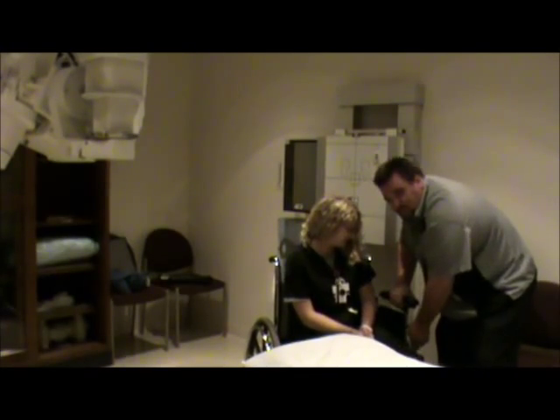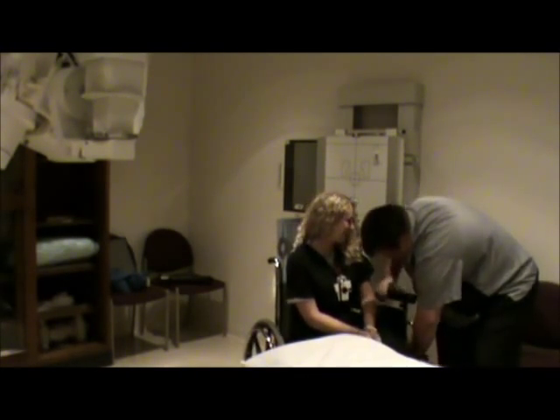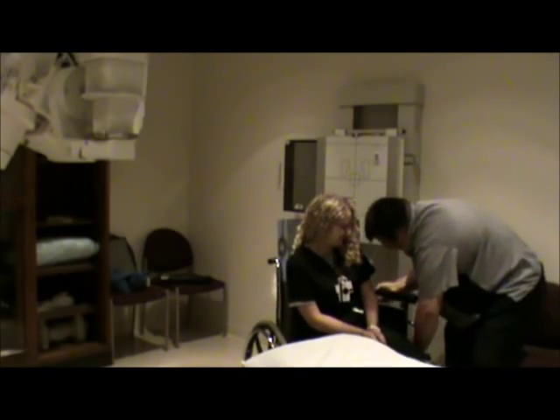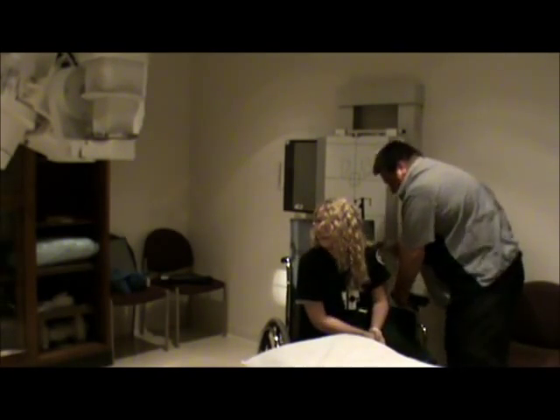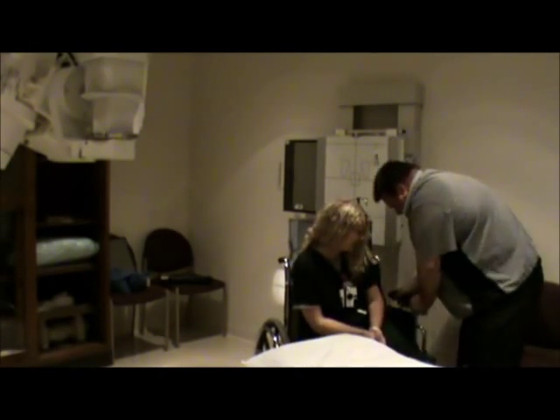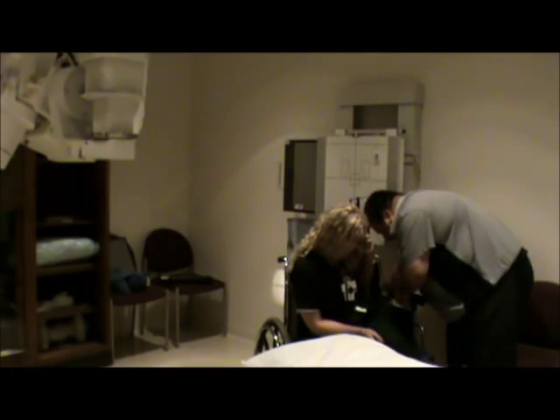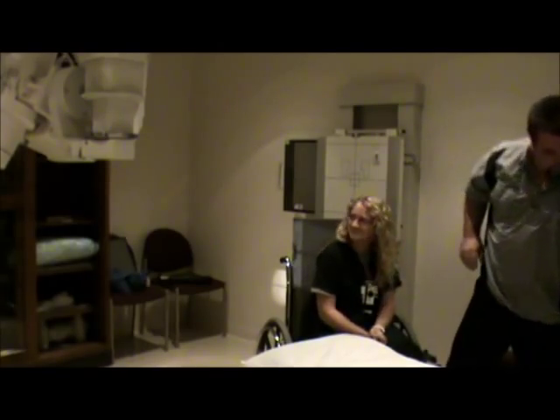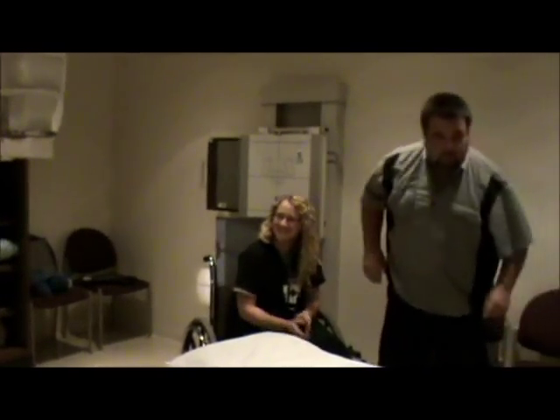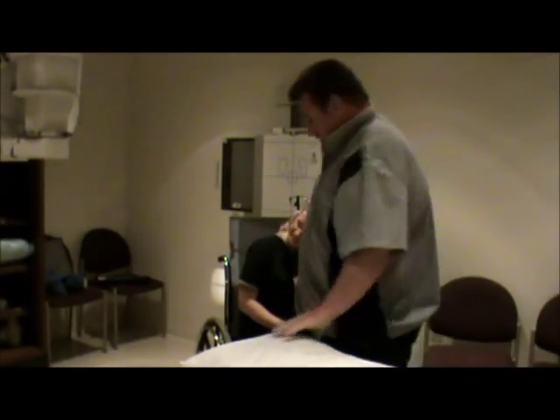Sometimes removing the wheelchair handles can be a challenge — hopefully you won't have to work that hard to get them out.